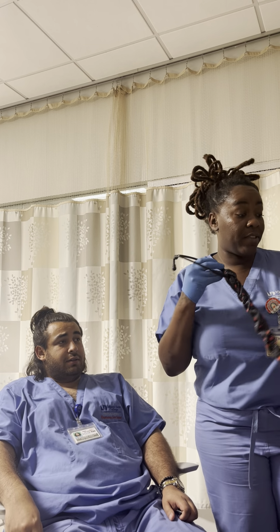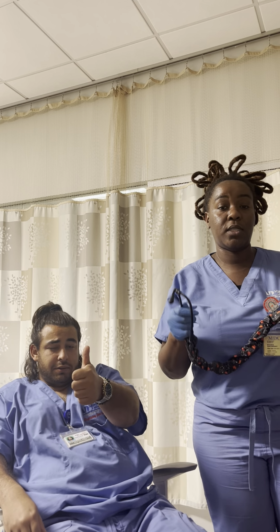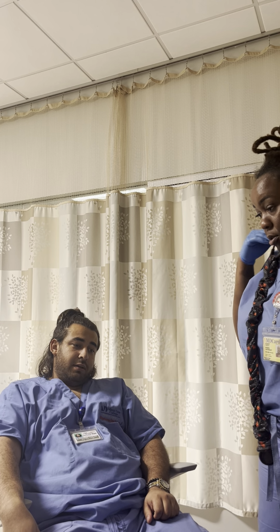So we're going to, after this last one, we're going to assess again because it's important to always assess afterwards, okay? After you perform the IS, okay?